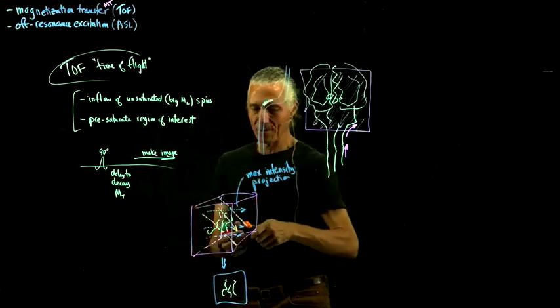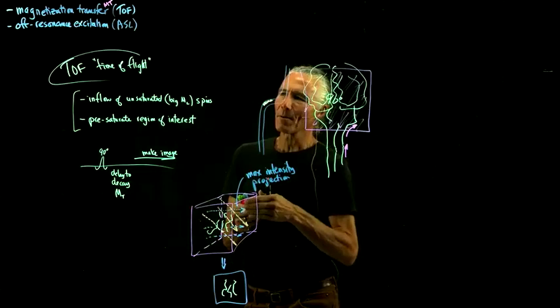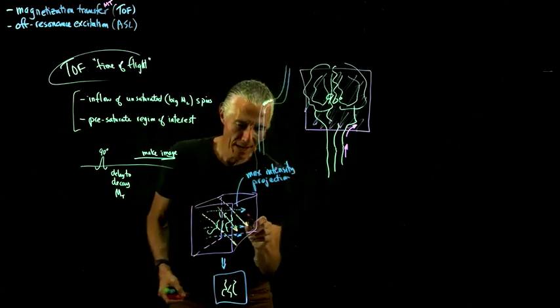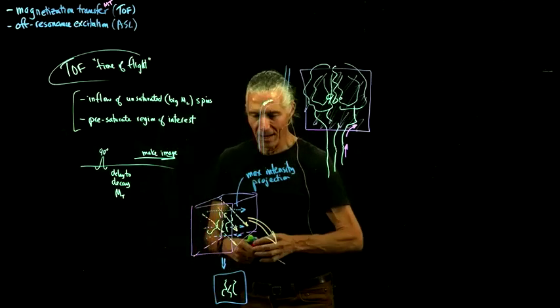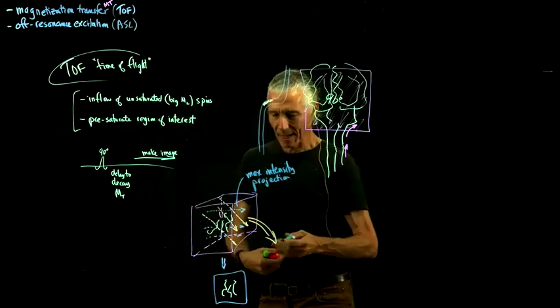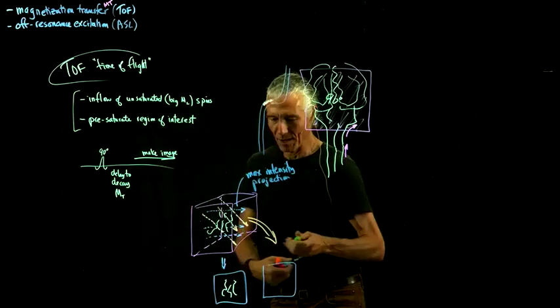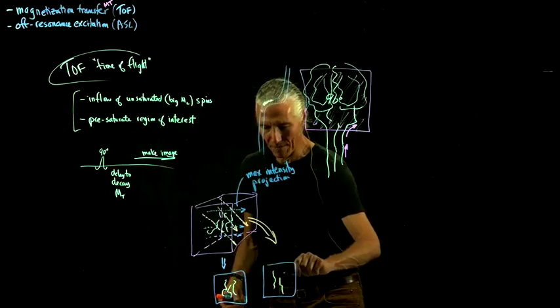I over-exaggerate. You could just go through the block 1 degree away from the last time you went through the block. And then you just make that into a picture. And you'll get a picture that basically has the blood vessels rotated in it. So now you'll see the same thing, but they'll be rotated around a little bit. They'll look at a different angle.